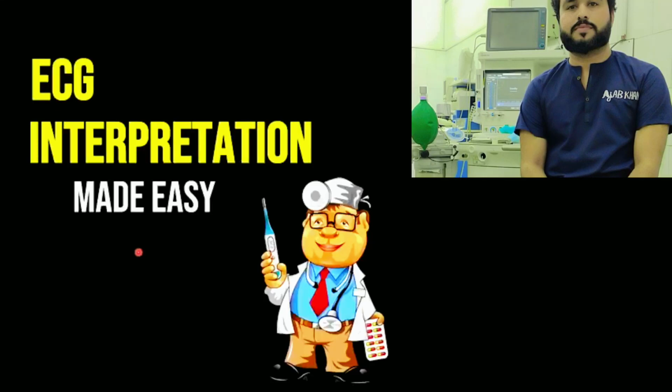Okay, welcome to the first video of the ECG interpretation made easy video series. By the end of this video series, I'll make sure that you have mastered all the important ECGs, all the high yield ECG rhythms and their abnormalities. We will solve ECGs together, we will learn ECGs together, we will interpret different 12 lead ECGs.